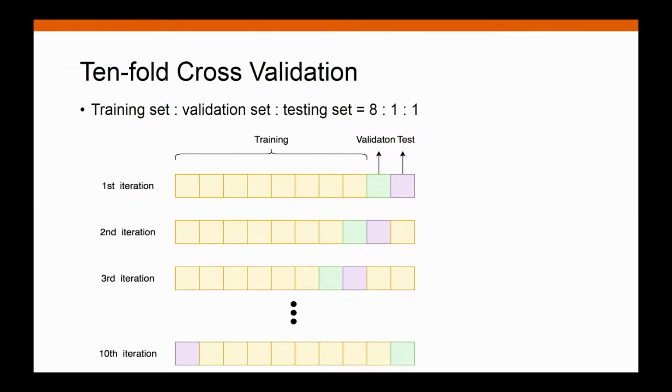For all the images in our data set, we divided them into training, validation, and testing sets using the ratio 8:1:1. The reason we separated the validation set from the training set is because we want to prevent the overfitting problem that is pretty often seen in the machine learning domain. We also use 10-fold cross-validation just to lower the variance of our algorithm.